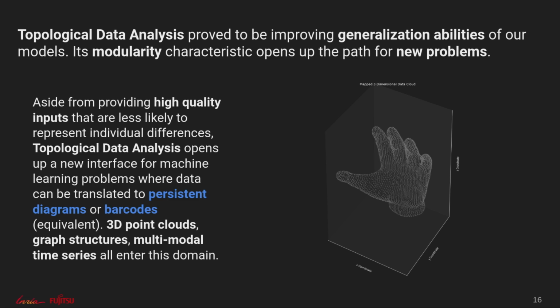Moreover, the modularity of such a model allows us to build and add new channels, such as possibly a wavelet transform channel, which also gives a good description of the ECG's time series. And finally, we also give a new benchmark on 5 open source datasets and are excited about performance improvements through the release of later datasets, such as presented in the Stanford paper, where they collect an annotated dataset of 64,000 ECG records from 29,000 patients.